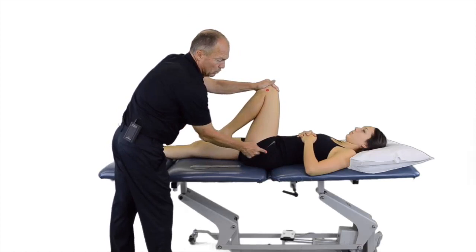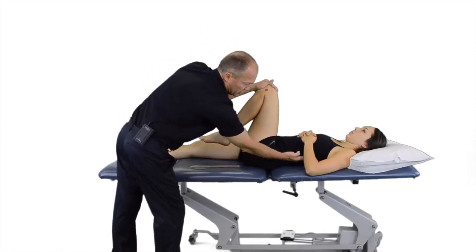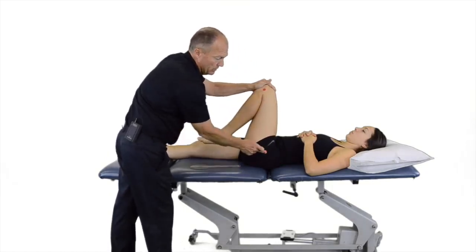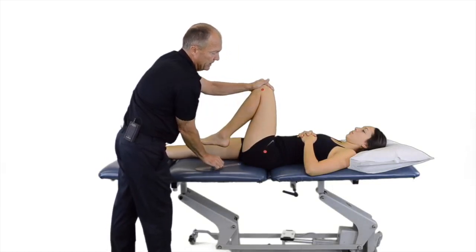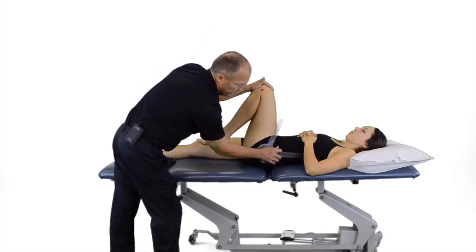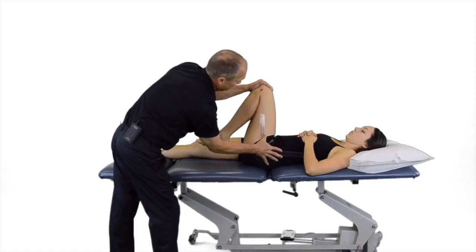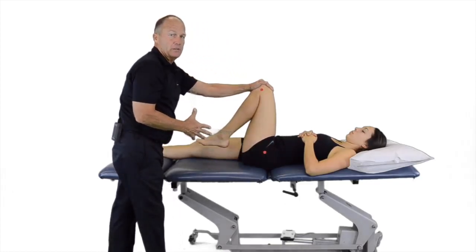Our landmarks will be the greater trochanter of the hip. Our stationary arm is along the axillary line of the trunk, level or parallel with the table. Our moving arm is from the trochanter at the hip to the lateral epicondyle of the knee. We would take our measure with the stationary arm, aligning in this degree, and then use our moving arm along the trochanter to our lateral epicondyle line. And that would be a measurement for hip joint flexion.